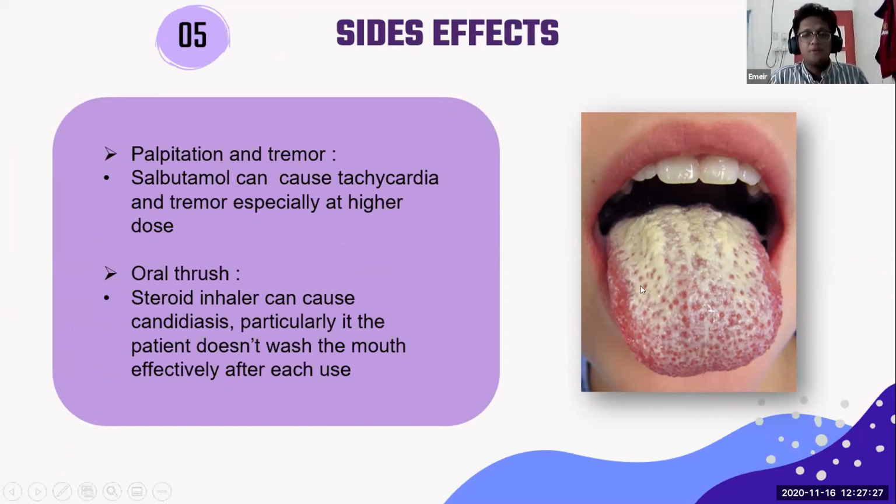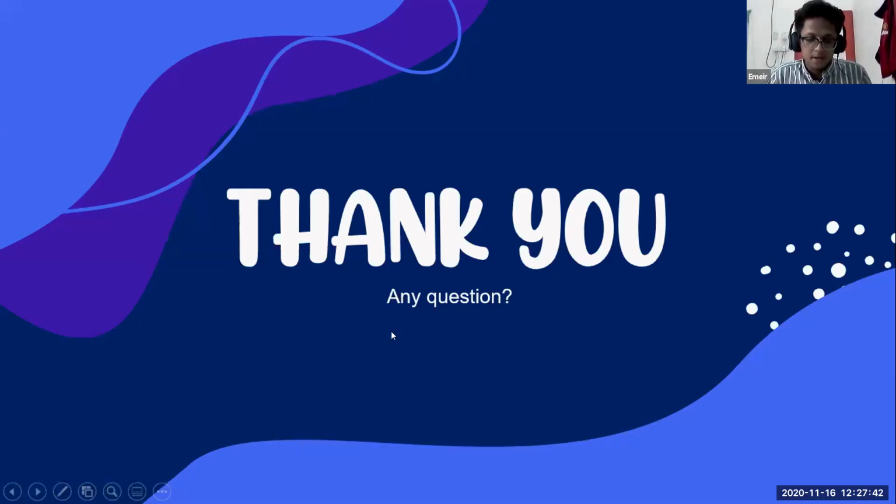Again, it's important to rinse the mouth after usage of the MDI. Steroid inhaler can cause candidiasis, particularly in the patient that doesn't wash the mouth effectively after each use of the MDI. So this is my last slide, and thank you. Any questions? And I'm sorry for the hectic of the presentation.